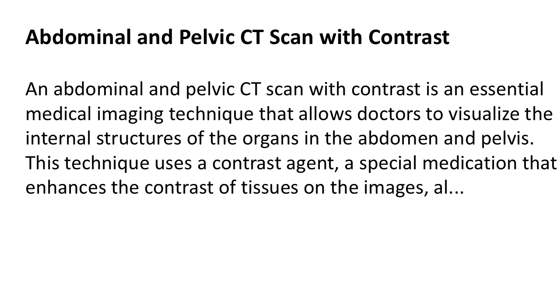Abdominal and pelvic CT scan with contrast. An abdominal and pelvic CT scan with contrast is an essential medical imaging technique that allows doctors to visualize the internal structures of the organs in the abdomen and pelvis. This technique uses a contrast agent, a special medication that enhances the contrast of tissues on the images.